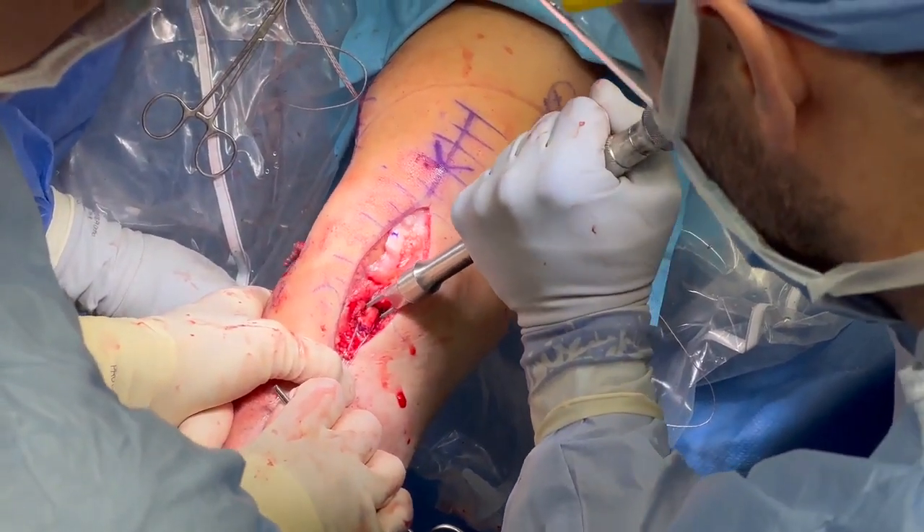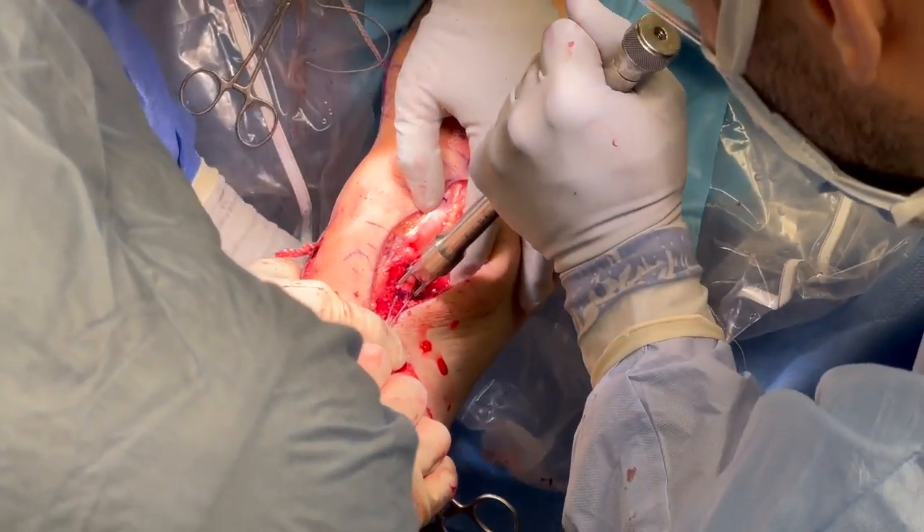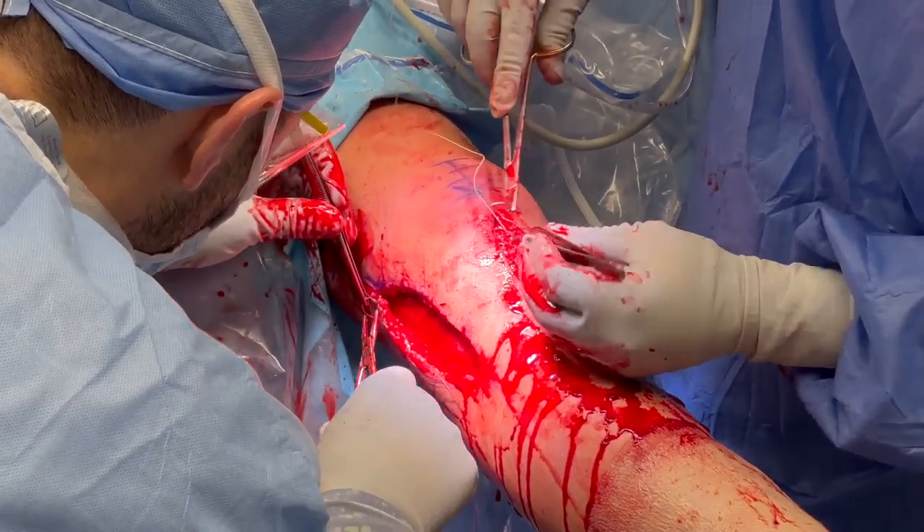The ACL graft is secured in the tibia with the knee in extension and with neutral rotation. Two staples are used to secure the graft in a bone trough. The deep and superficial tissues are closed with suture.